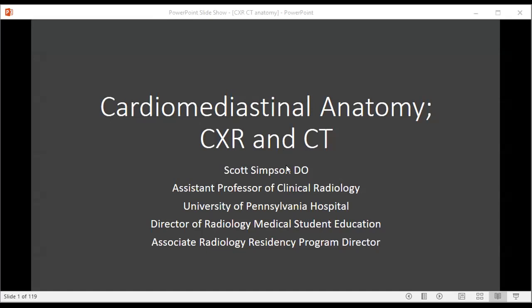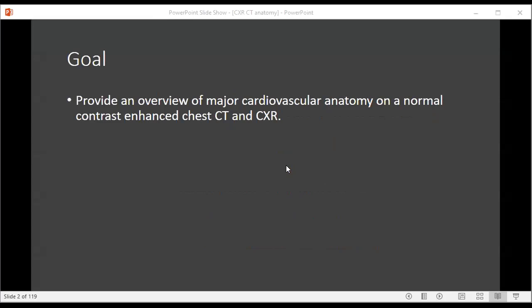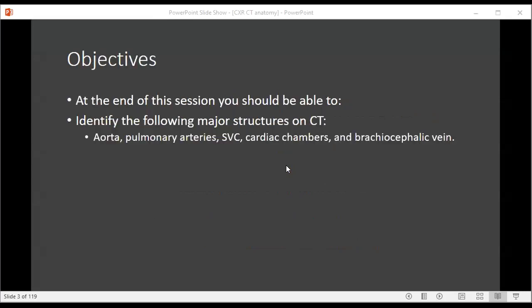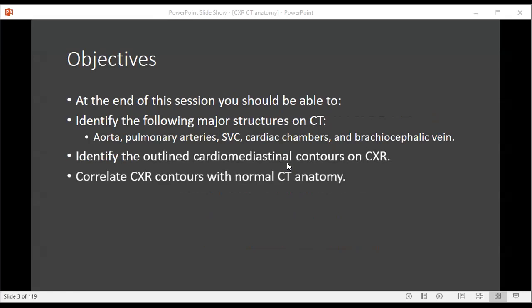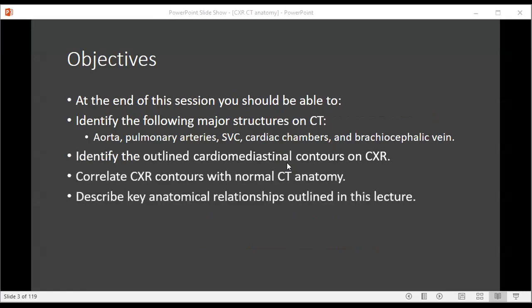Hi, my name is Scott Simpson and this is cardiomediastinal anatomy on chest X-ray and CT. The goal of this lecture is to provide an overview of major cardiovascular anatomy on both the normal contrast-enhanced chest CT as well as chest X-ray. At the end of this session you should be able to identify the following major structures on CT, identify the outlined cardiomediastinal contours on chest X-ray, correlate those contours on chest X-ray with normal CT anatomy, and describe key anatomical relationships outlined in this lecture.